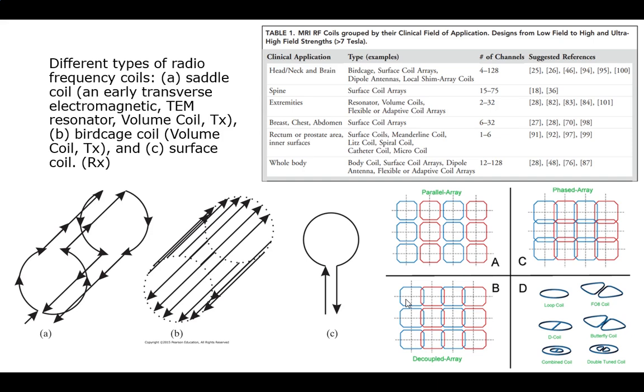But if you think about it, each of those array elements can be assigned to different areas physically, which means you can really tune it quite nicely to where things are. These are the basic overlap patterns that are in here. And then each of these can be a loop coil, or one of these figure-eight coils. The only difference between these and these is whether these are independent coils here, or whether they have the butterfly crossover between them.